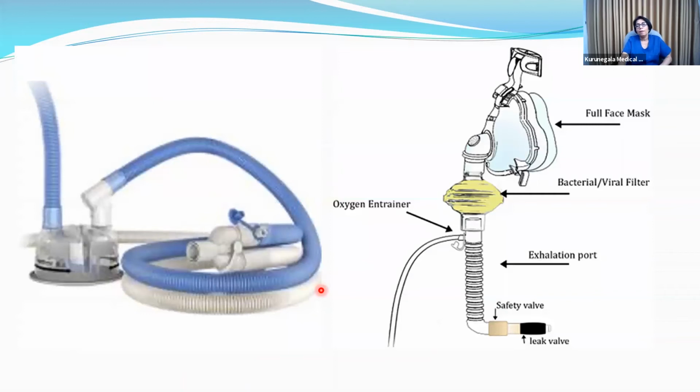Okay. How does CPAP improve one's oxygenation? We create a positive pressure inside the airway and in the alveoli. Because of this positive pressure, the fluid gets dried up, the compliance of the lung improves, and of course, as a result of this, your oxygenation is improved. And if the patient is in heart failure, that especially helps.